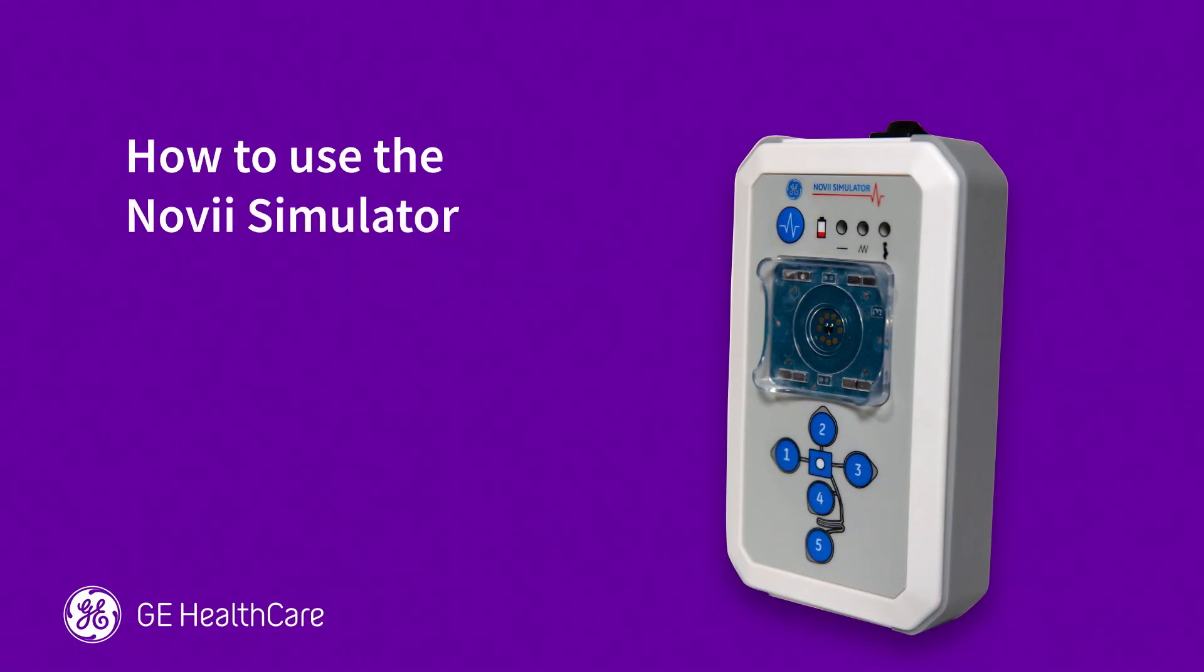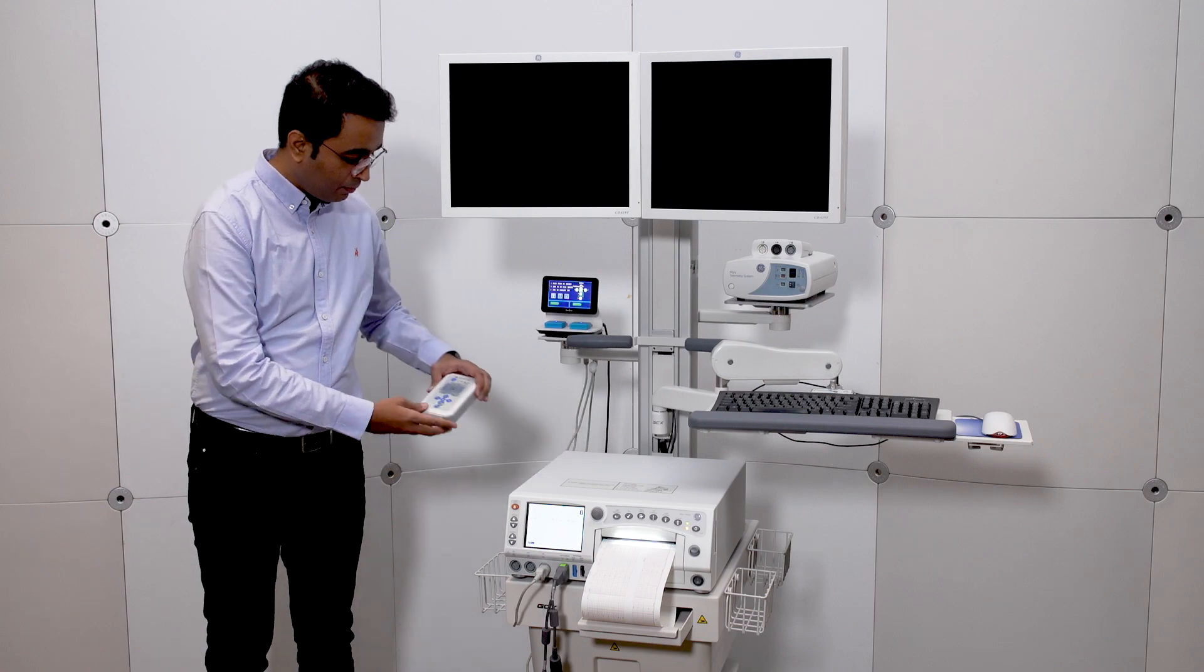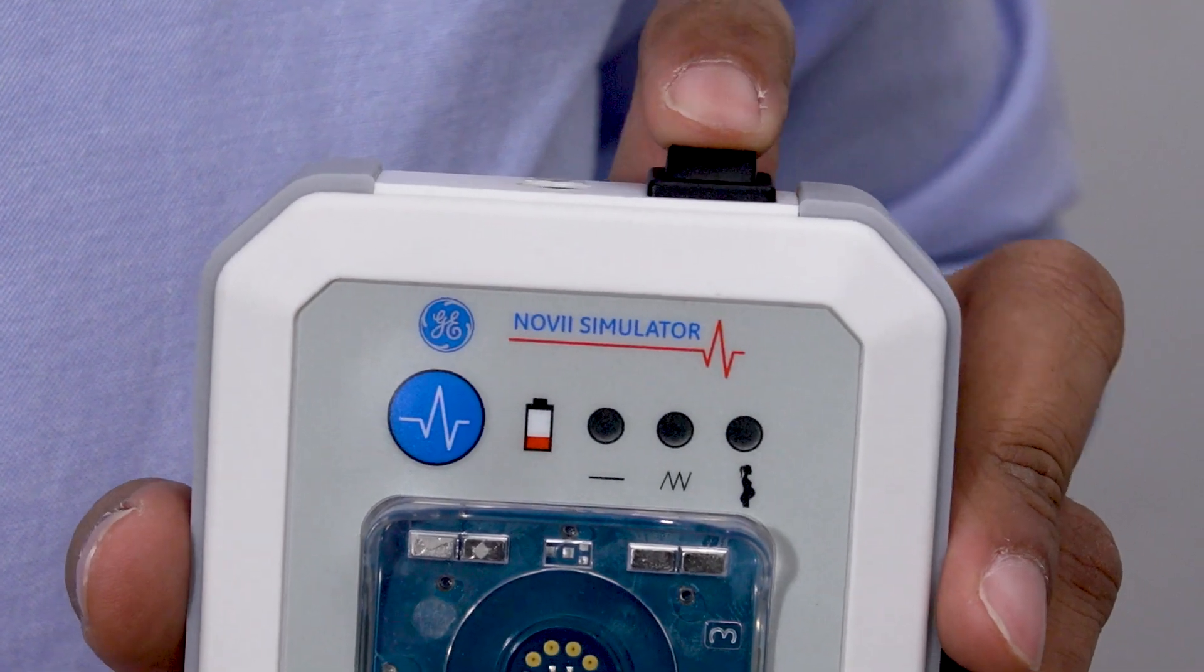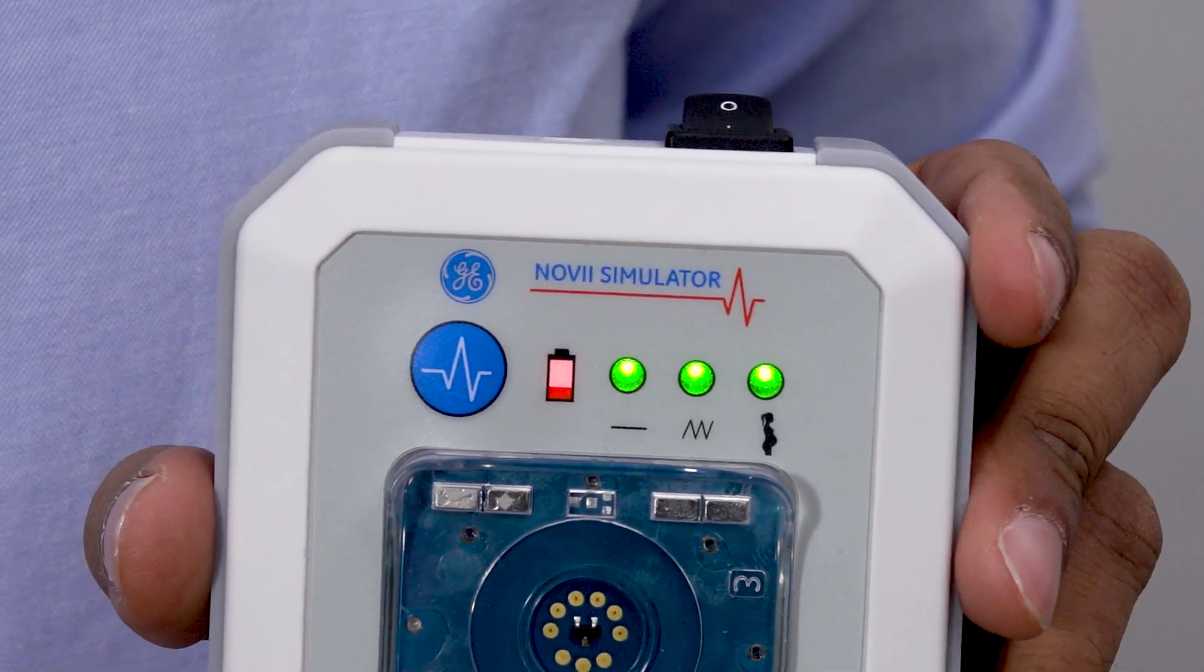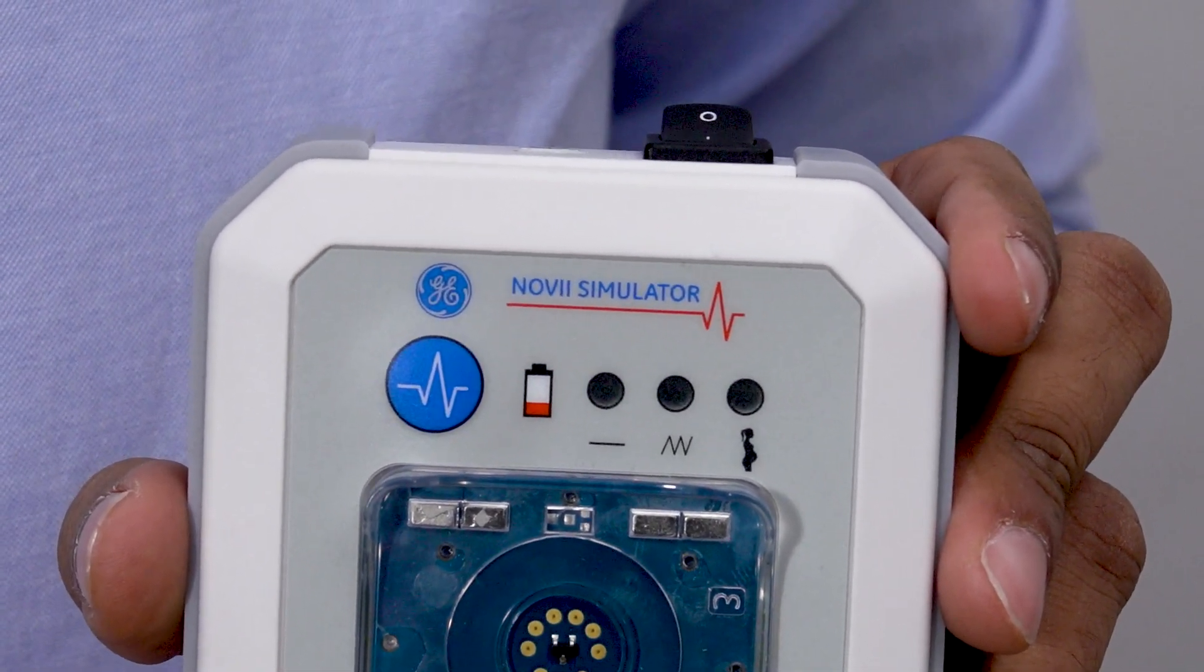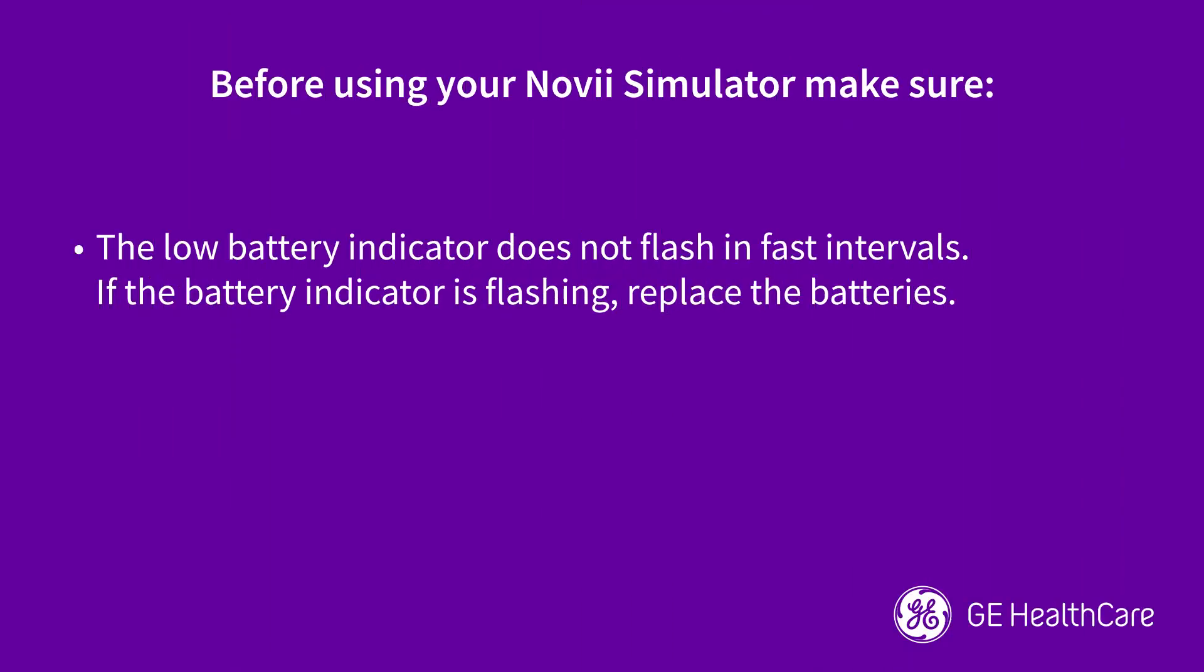Now that we are acquainted with the Novi simulator, let's cover how to use it. Press the power switch to turn the device on. As you can see, all LED indicators come on, followed by a beep. The constant mode is activated by default. Before we go further, make sure the battery indicator does not flash in fast intervals. If the battery indicator is flashing, replace the battery.